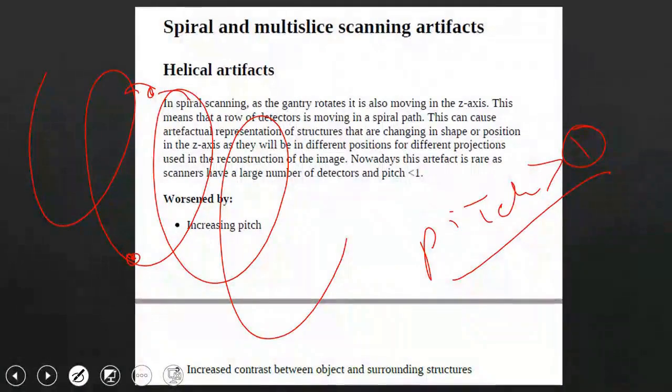However, there is a significant difference between improving the smoothness of the image and the quality of the image. This image is smooth, but it lacks resolution. Sometimes you look at an image and feel that it is very smooth, but the image has no resolution. Here, you have limited yourself. Increasing the pitch factor results in a loss of resolution, even if there is interpolation. Even if you improve the image quality, you are making it smoother or improving the blurring effect that exists. But at the level of resolution, you have experienced a loss in resolution due to a large pitch factor.